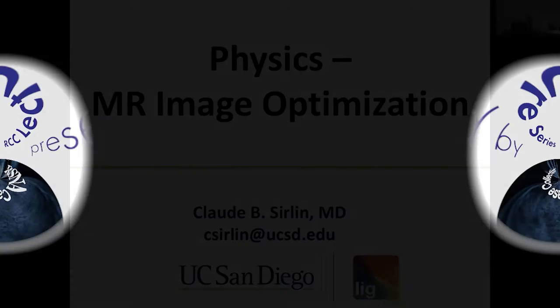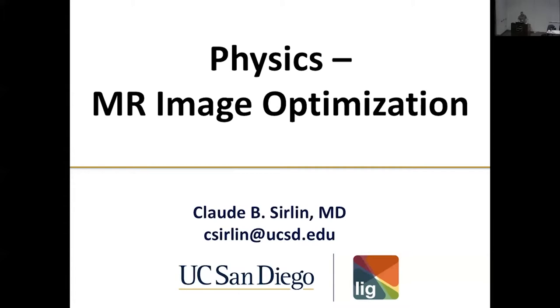Okay, well, anyway, we're going to move on to image optimization. But before we do, I just wanted to answer a question that was asked of me after the last lecture. The question was, in chemical shift of the first kind, that's when the water image and the fat image sort of move relative to one another.